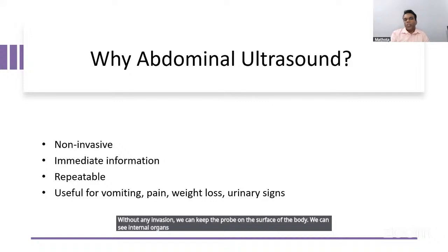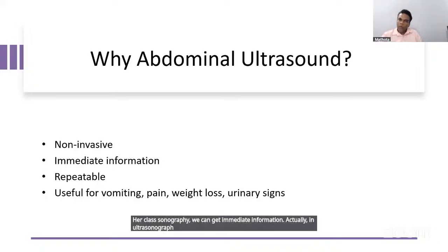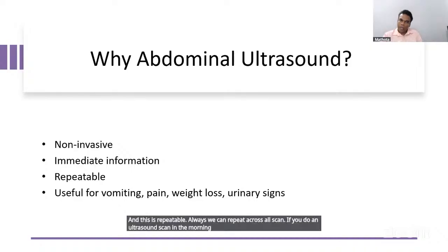Then with ultrasonography, we can get immediate information. Actually, in ultrasonography, we get live images. And this is repeatable. We can always repeat an ultrasound scan. If you do an ultrasound scan in the morning, in the evening also you can do another scan and compare, because this technology is not harmful to the patient.